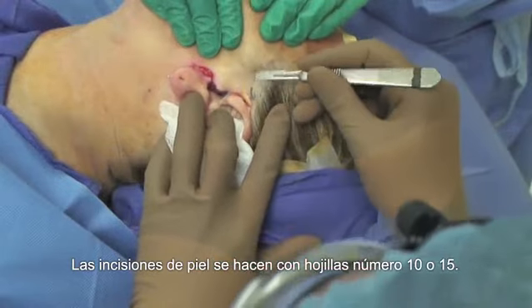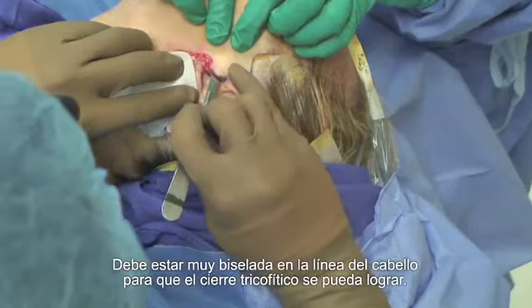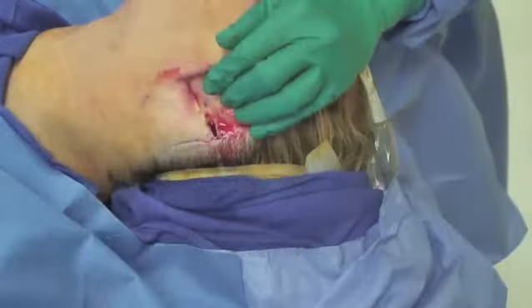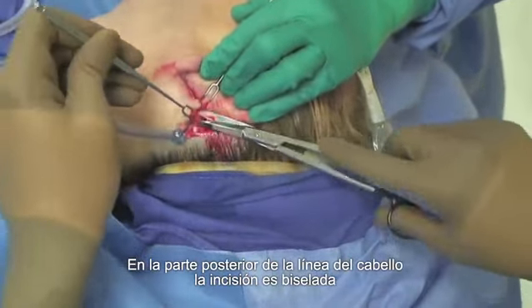Skin incisions are performed with a number 10 or number 15 blade. The incision is beveled very sharply at the hairline so that trichophytic closure can be established. Posteriorly, along the posterior hairline, the incision is beveled in a trichophytic fashion.